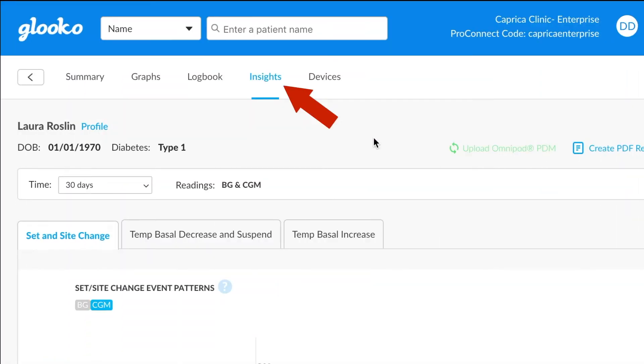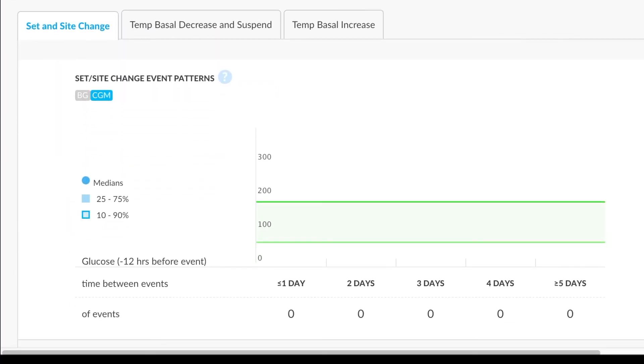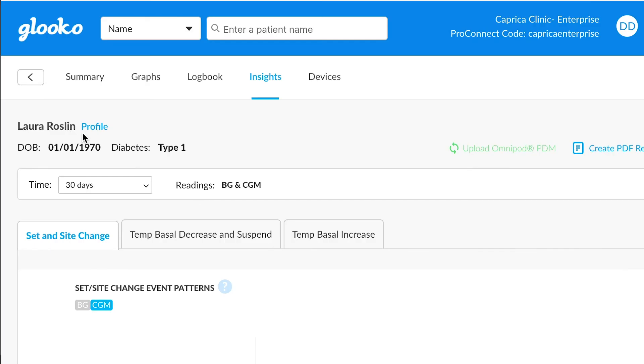Insights is a place where we can view trends in common pump events like site changes and temp basal.